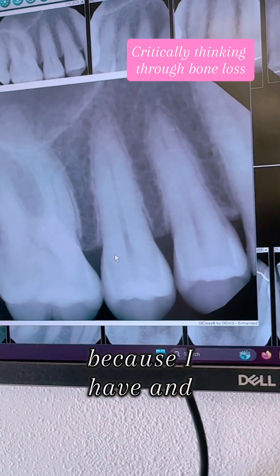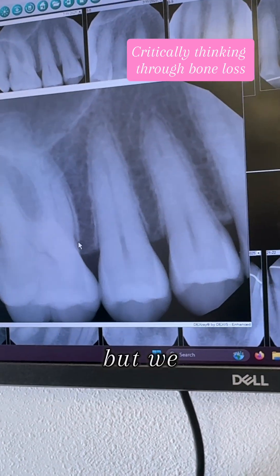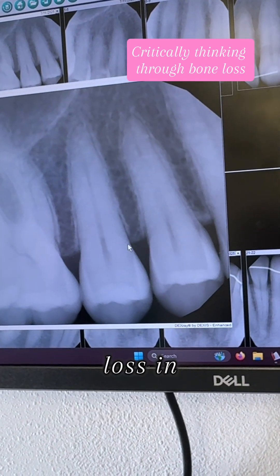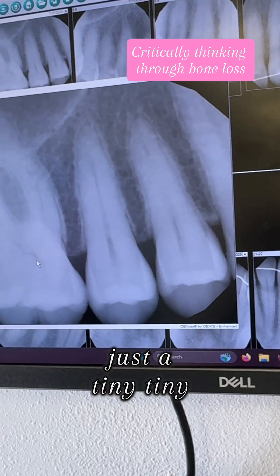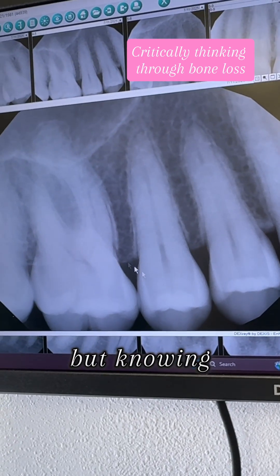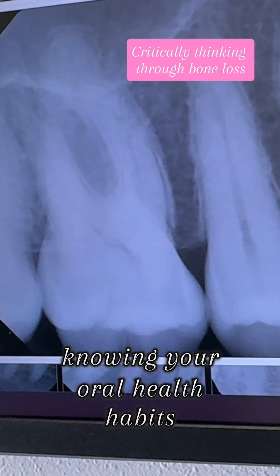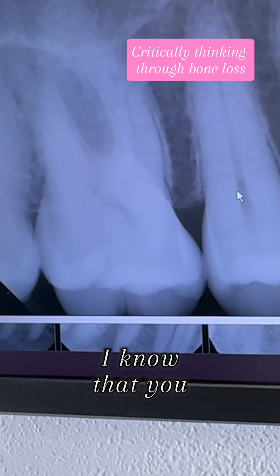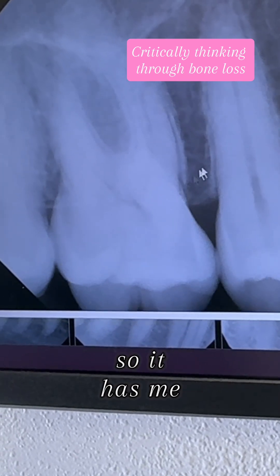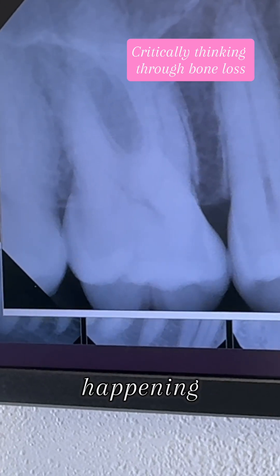We have a little bit of foreshortening, but we do have some bone loss in between here — just a tiny bit. But knowing your probe depths and your oral health habits, I know that you don't have periodontal disease. So it has me looking at other things — why would this bone loss be happening?